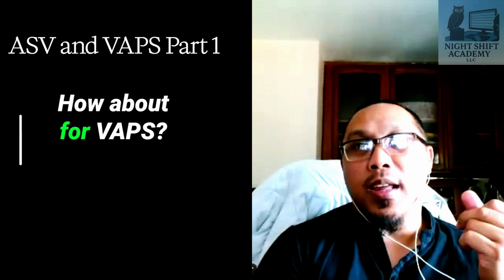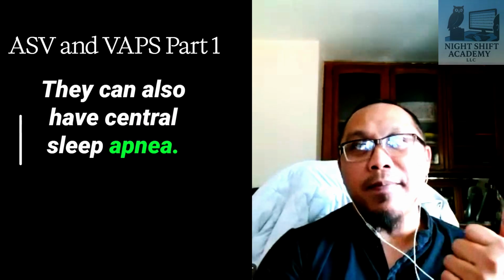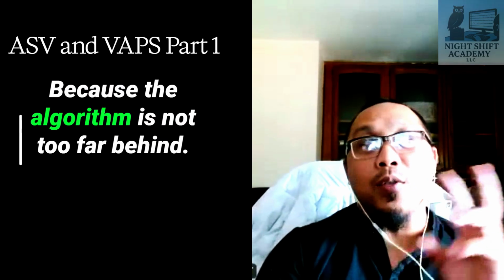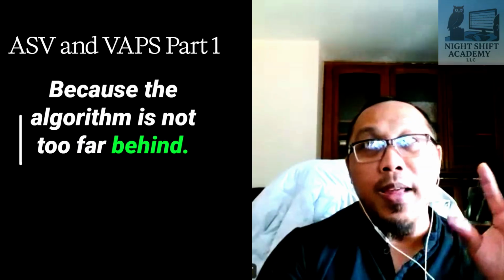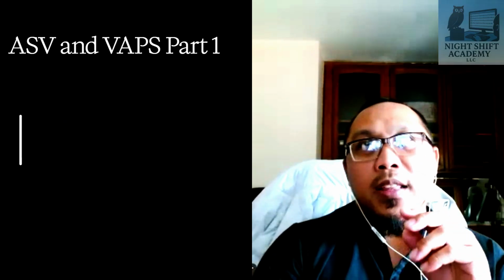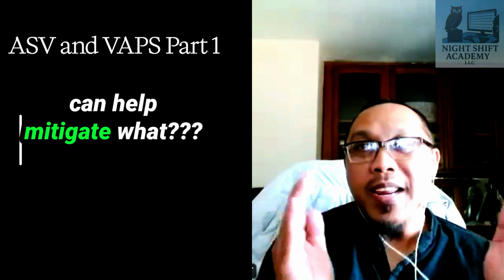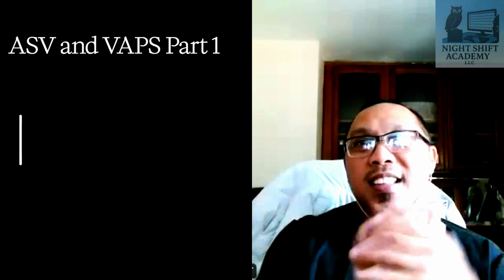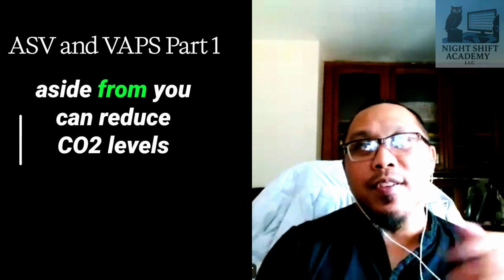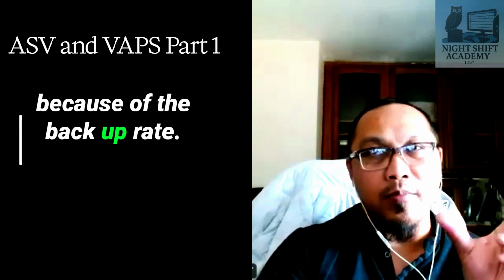How about for VAPS? Yes, they can also have central sleep apnea because the algorithm is not too far behind. The difference is that on VAPS, even though they both have a backup rate, and backup rates can help mitigate central apnea, aside from reducing CO2 levels, both can address central apnea because of the backup rate.